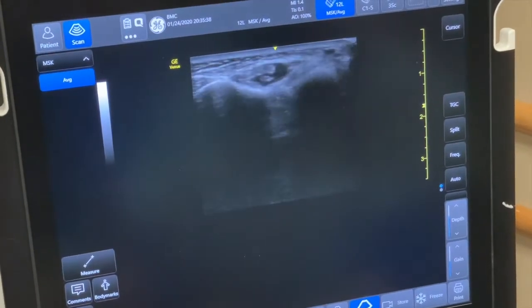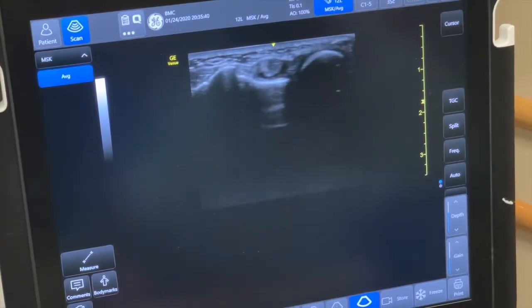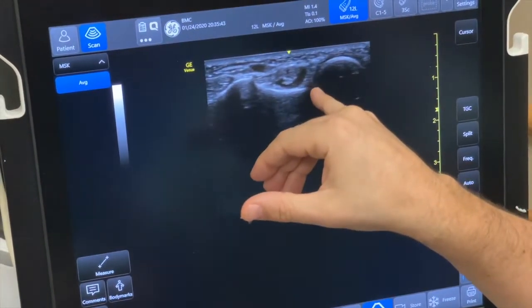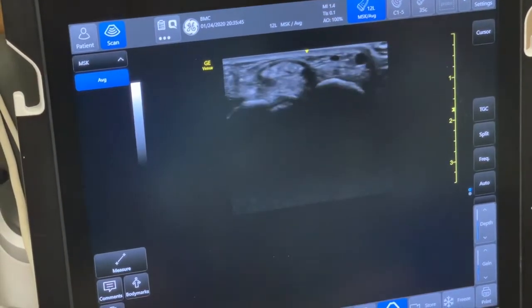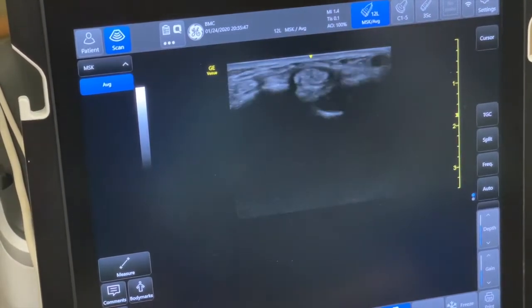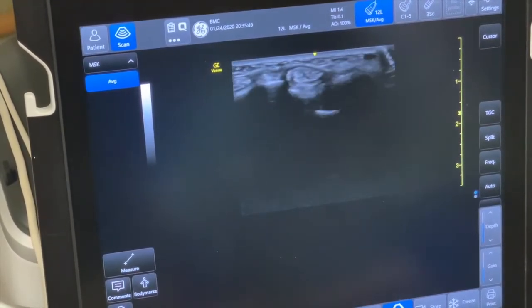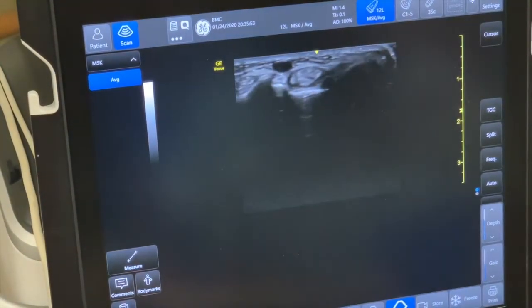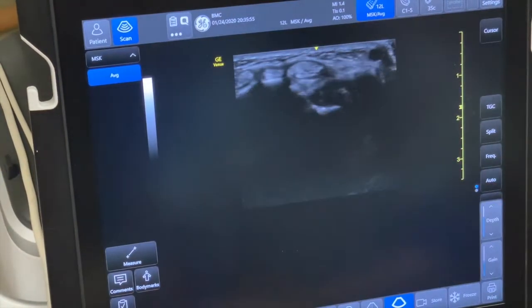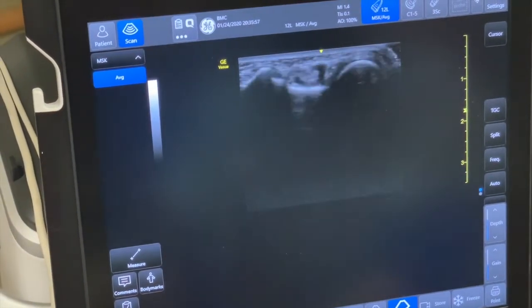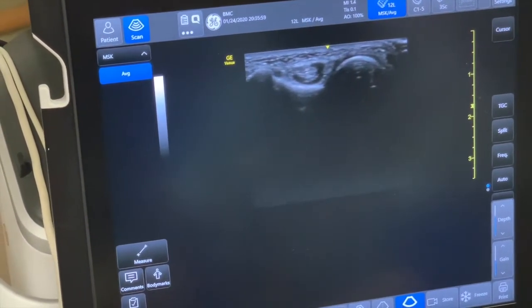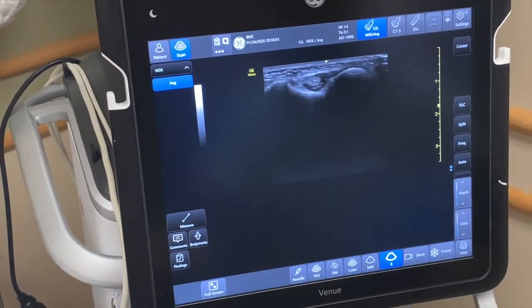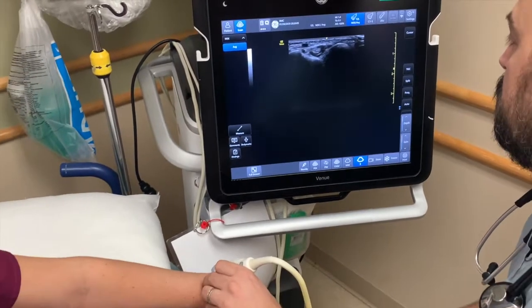If you were going to tap the wrist, you're going to aim for the space between the carpal bones. You can find the ulna and come along next to the tendon sheath and try to get into the joint space. If there is an effusion, you'll usually see fluid underneath the extensor tendon bundle there.